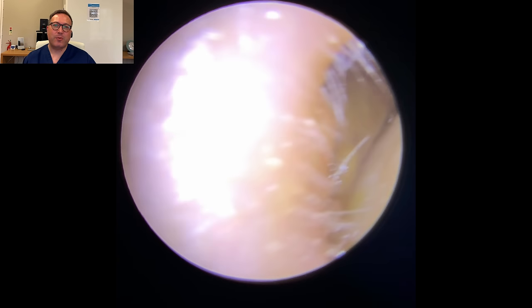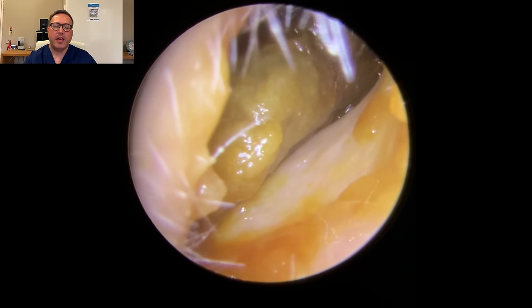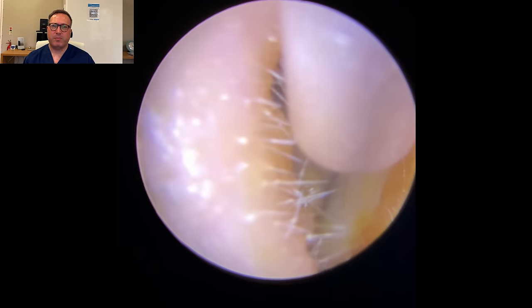Hi everybody, this is Rhys Barber from Audiology Associates. Thank you very much for watching our earwax removal video today. You can see this lovely lady's coming through to clear very blocked up ears on both sides.